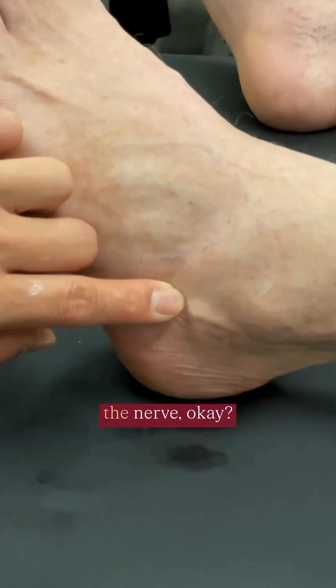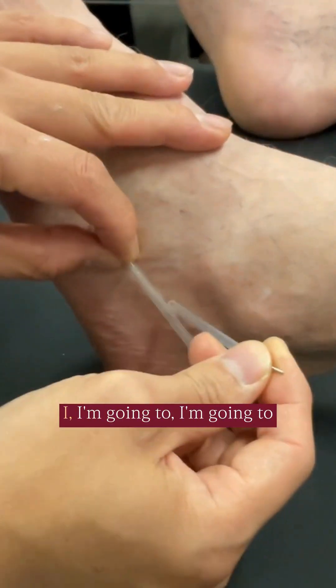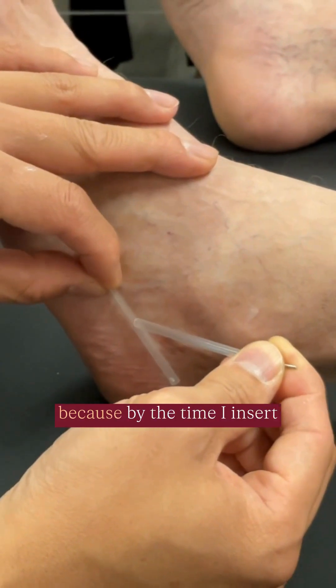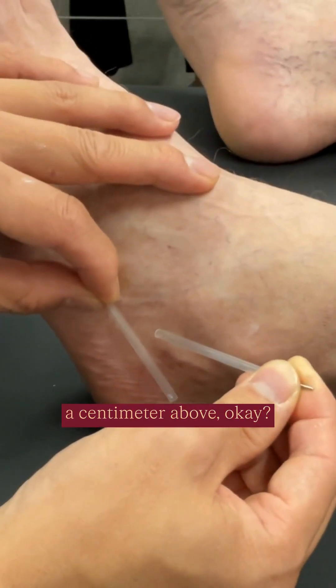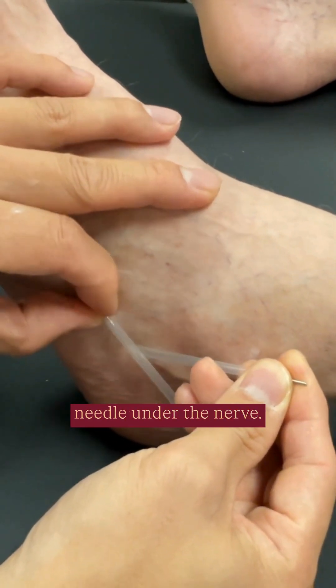Once you've plucked the nerve — so let's say the nerve is right here — I'm not actually going to insert right on the nerve, because by the time I insert it, I would have overshot. I'm going to start about a centimeter above, so that after I insert, I advance the needle under the nerve.